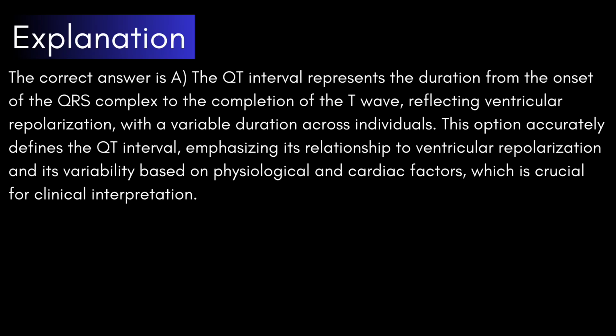The QT interval represents the duration from the onset of the QRS complex to the completion of the T wave, reflecting ventricular repolarization with a variable duration across individuals. This option accurately defines the QT interval, emphasizing its relationship to ventricular repolarization and its variability based on physiological and cardiac factors, which is crucial for clinical interpretation.